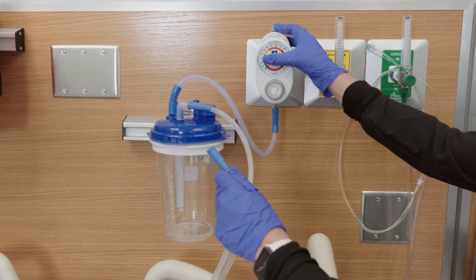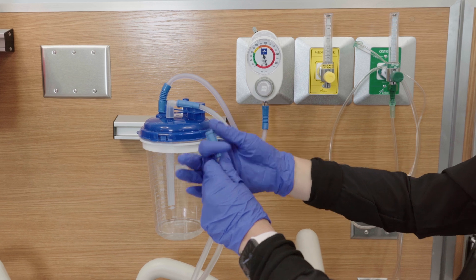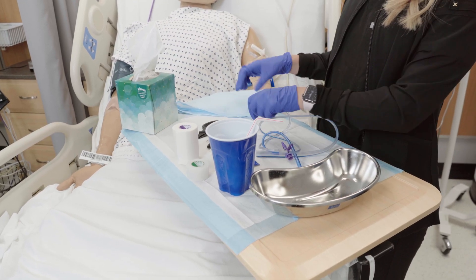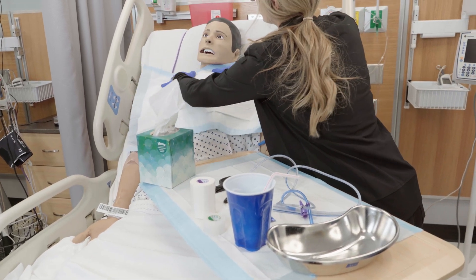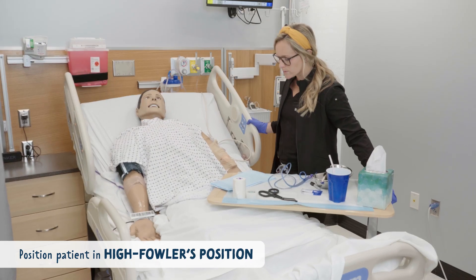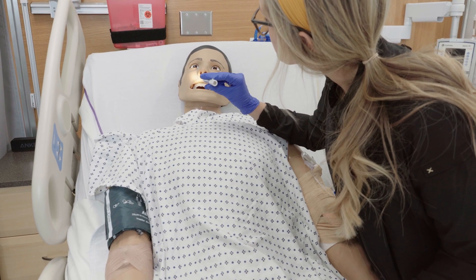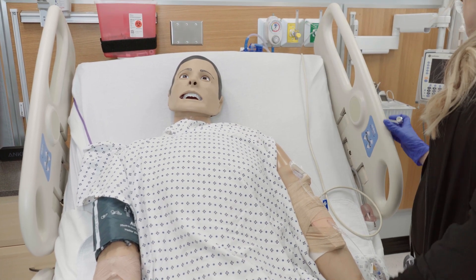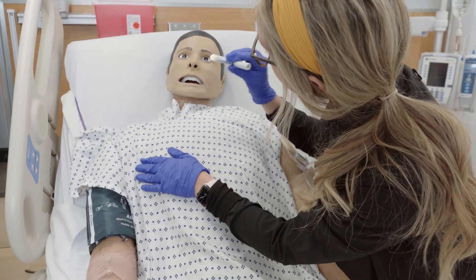We want to make sure our suction is set up and working before we insert the tube. Laying everything out on the bedside table can really help during the procedure so that everything's within reach when you need it. You want to position your patient in high Fowler's position, sitting them upright. Before you administer the NG tube, assess for any abnormalities in the nasal cavity, difficulty breathing out of either nare, or a known obstruction.